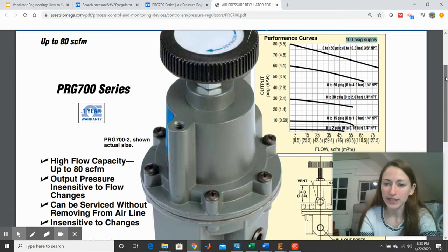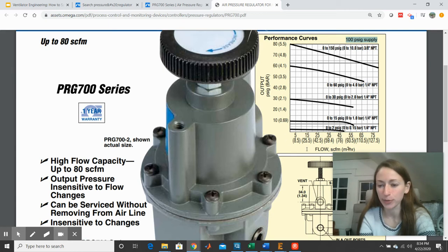And then the rest of the plot is a flow versus outlet pressure plot. So here's our little 0 to 2 psi regulator performance curve down here with 100 psi supplied to it. And according to how much flow is supplied to the device in cubic feet per minute, we look at how the pressure drops off as a result of that. Okay, so this is in cubic feet per minute. So in terms of the flow that we have, 60 to 120 standard liters per minute, we're down here in this lower portion of the performance curve.